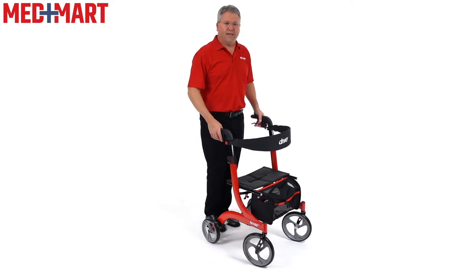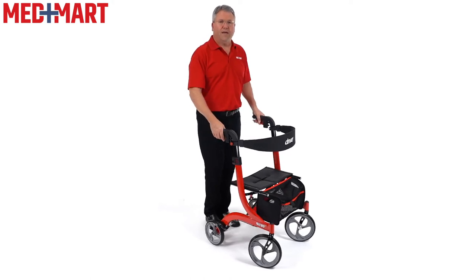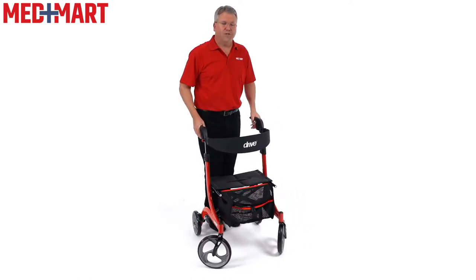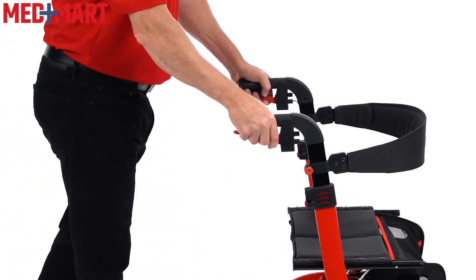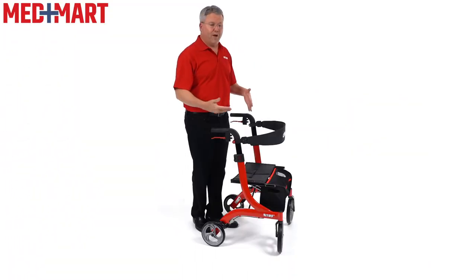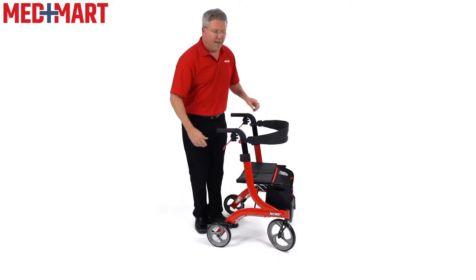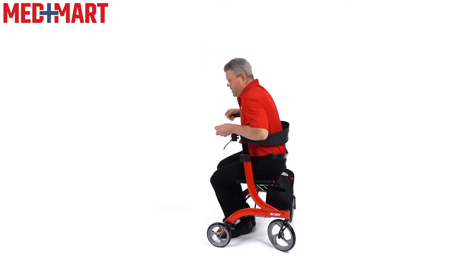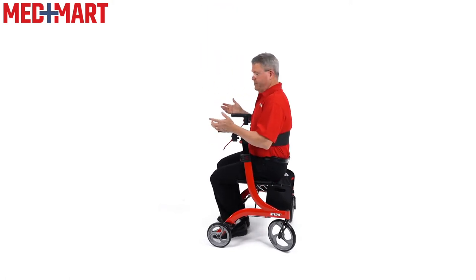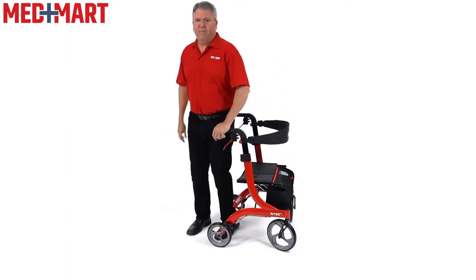You also have nice, easy-to-use brakes. With a gentle squeeze on both sides, there are two different brakes, one on each rear wheel, which makes it very easy to get a little extra support. If I'm walking and I feel like I'm losing my balance and need to stop, it makes it easy to squeeze. If you need a longer brake, the whole idea of having a seat is to be able to lock the brakes — and you always want to make sure you're doing this. Then you can turn, use the armrest for support, and sit down and rest. When ready to walk again, use the armrest to help stand up and move around.